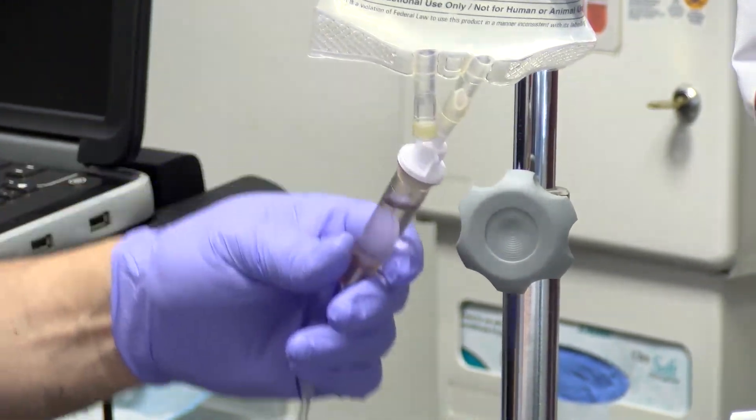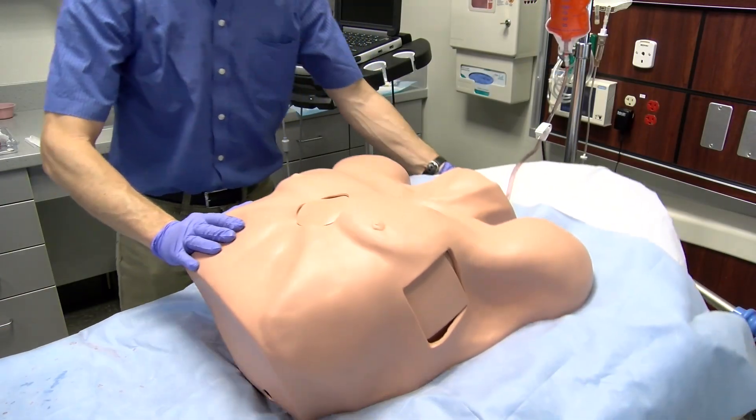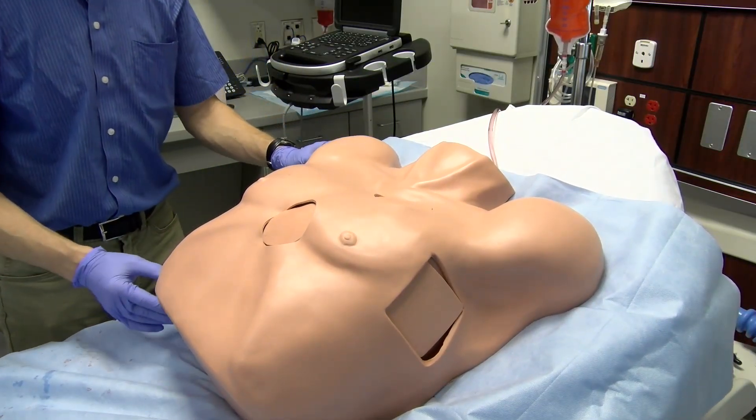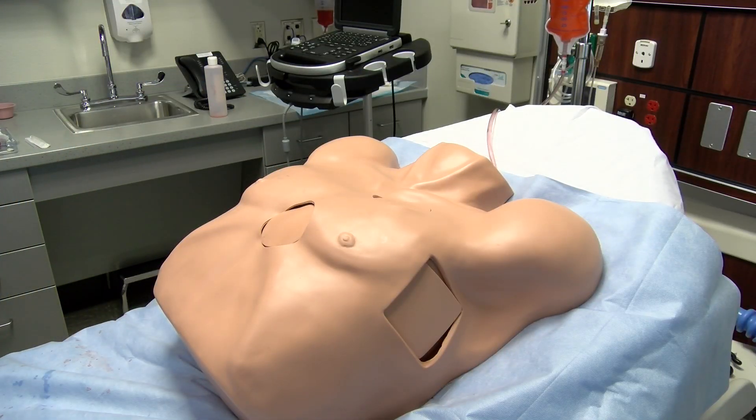The patient should be placed supine with the head of the bed at 30 degrees to allow the effusion to move to the dependent portion of the pericardial sac nearest the planned insertion site at the subxiphoid process.